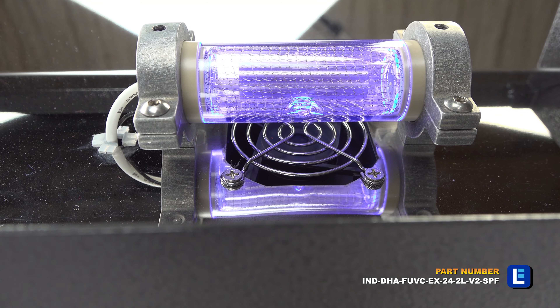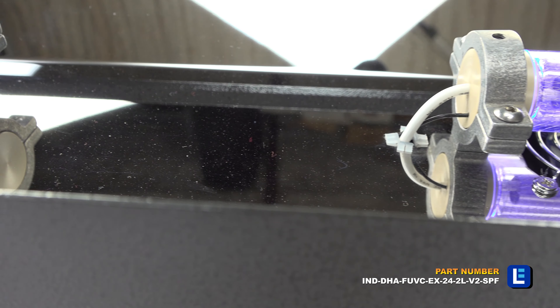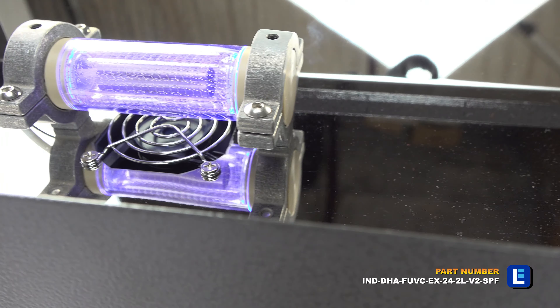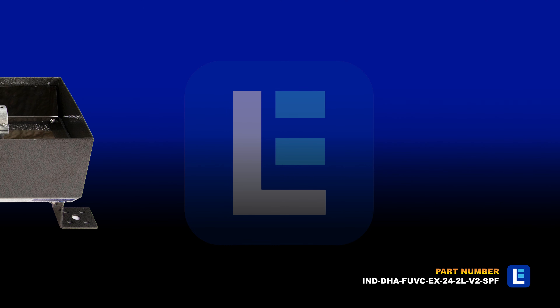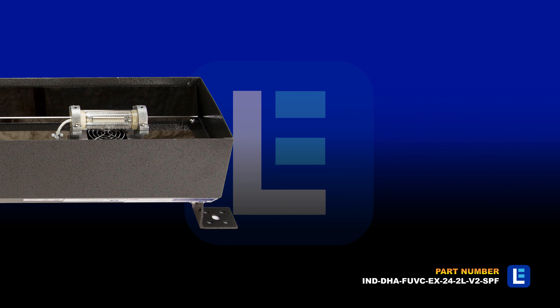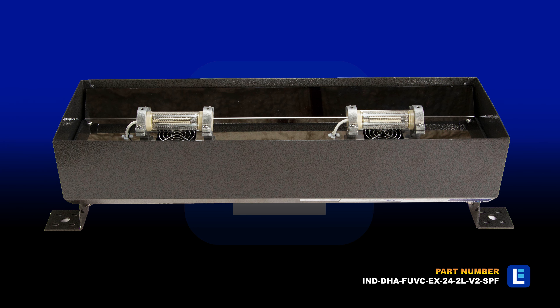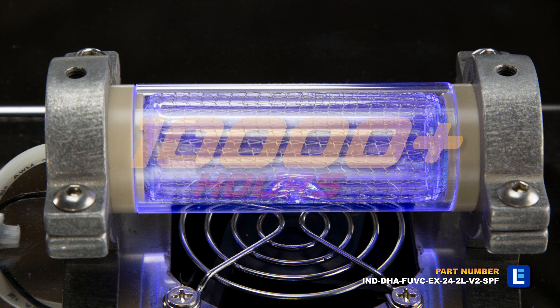This UV sanitation fixture is a powerful and sleek lighting solution for restaurants, businesses, and busy locations. The light emits a flood beam pattern and has an expected lifespan of over 10,000 hours.